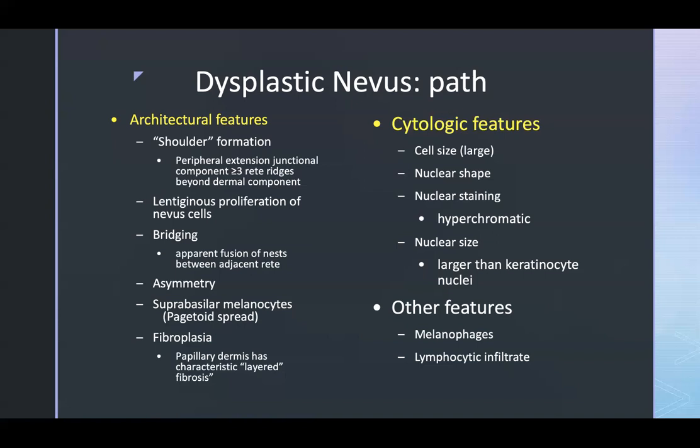Of course, there's no perfect immunohistochemical stain that has 100%, because you're going back and looking retrospectively at lesions and what they were called, and then you're doing immunohistochemistry after the fact. So understanding the true biology of PRAME and how it relates to melanoma and dysplastic nevi is still an evolving area of research, but it's pretty clear that the numbers are very highly supportive that lesions that have diffuse PRAME positivity in the nucleus greater than 75% are more often than not associated with melanoma as compared to benign or dysplastic nevi.